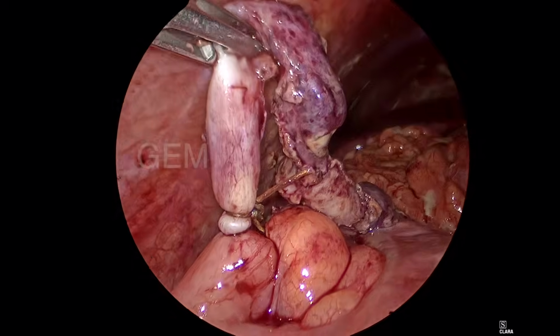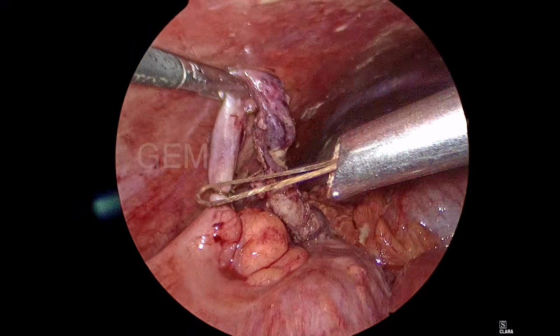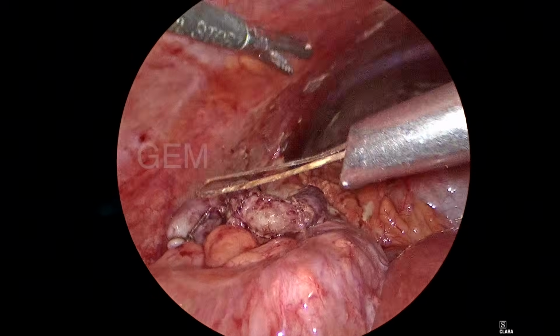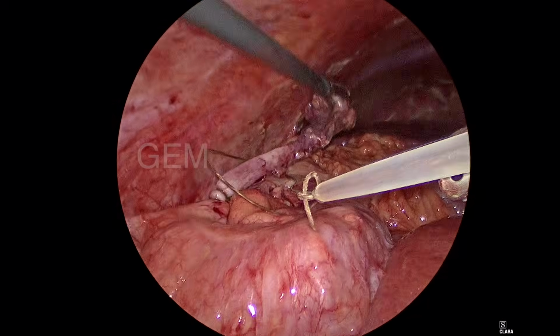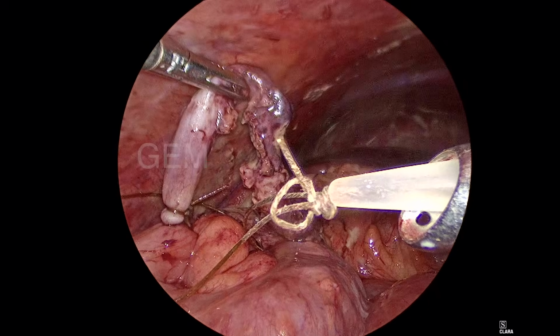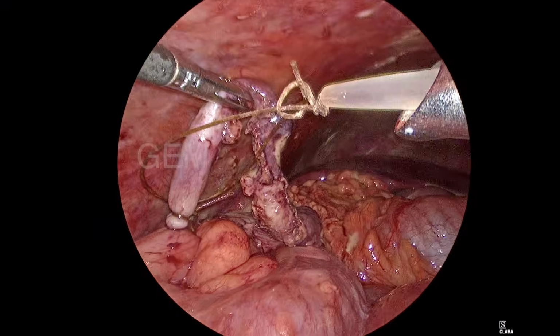And the standard teaching is you have to apply the third loop, and then you should not divide that loop, you have to keep it. That loop holds the appendix so that the appendix will not fall anywhere or get lost anywhere. So that is the standard teaching.